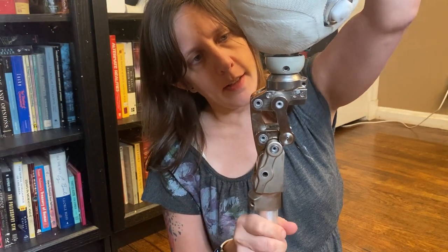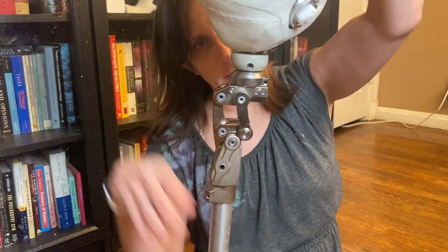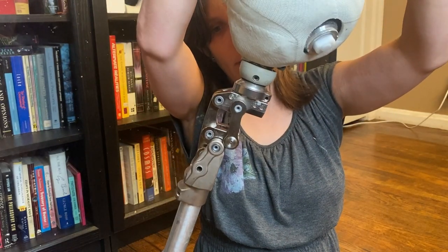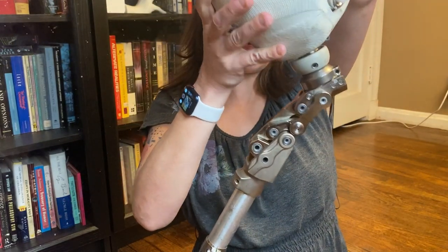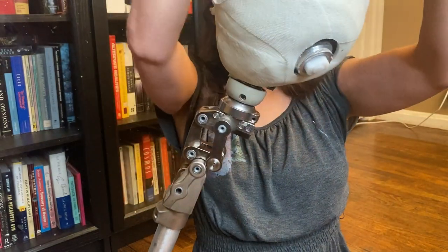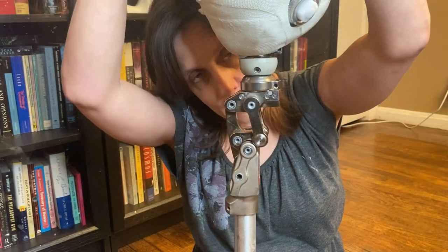The way this knee works is that when you put weight on the toe and you flex at the hip, then the knee bends. So right now I've got all the weight on the toe and I'm flexing at the hip to make the knee bend. And then it's got a hydraulic extension assist, so it basically extends itself using hydraulics.